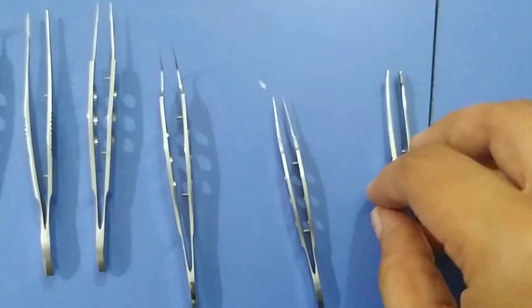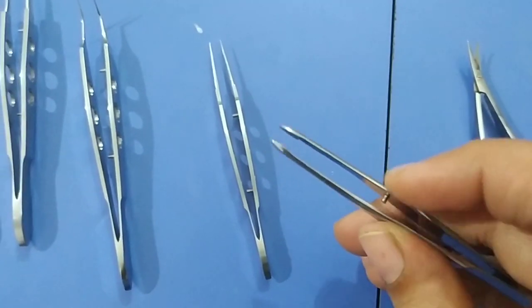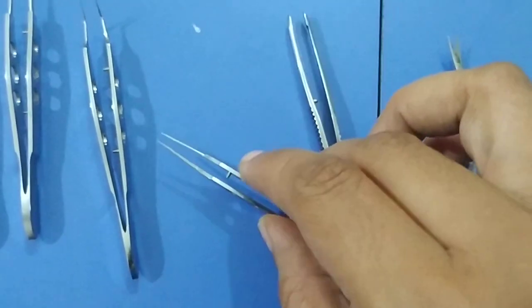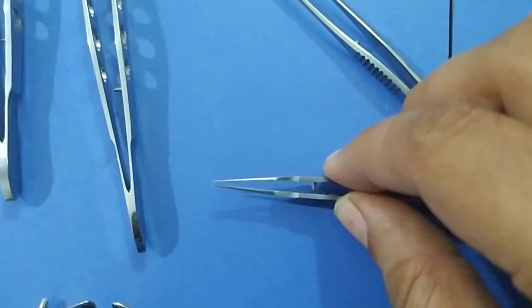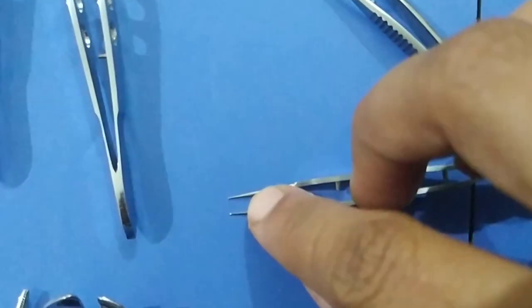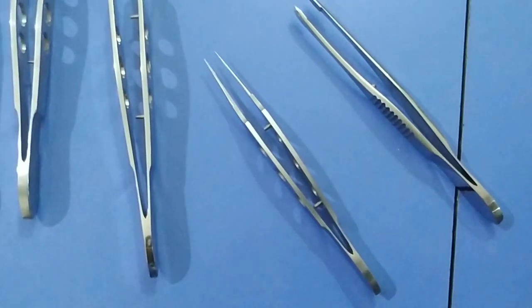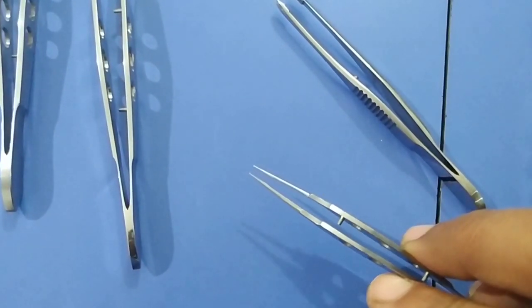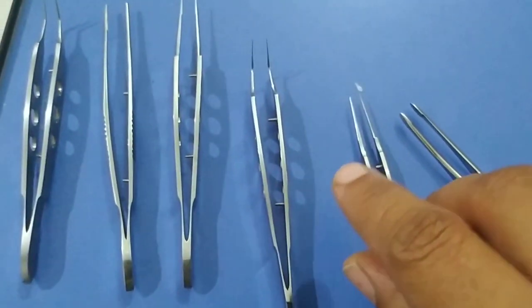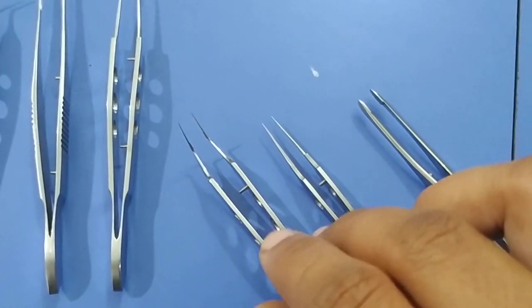Now, moving on to the forceps. This is an epilation forceps. It is used to pluck the trichiatic lashes from the upper or lower lid in cases of trichiasis or misdirected cilia. This is a one-tooth forceps. You can see at the edge there is a tooth, so it is a 1x2 one-tooth forceps. One-tooth forceps is used to hold the conjunctiva and Tenon's capsule for stabilization of the globe, to hold the corneal section while suturing in keratoplasty or extracapsular cataract surgery.